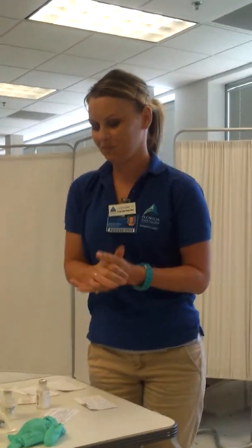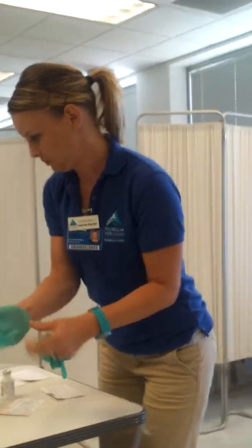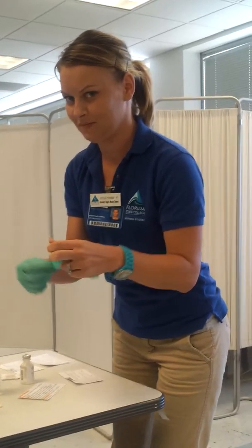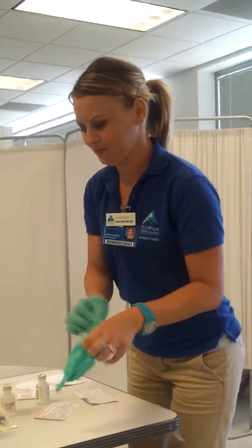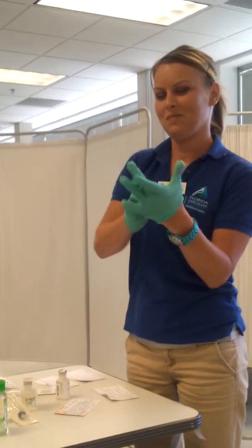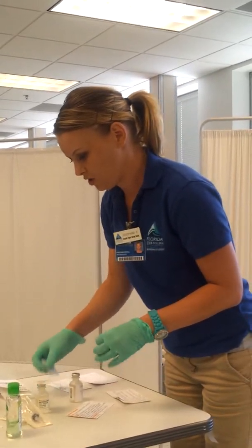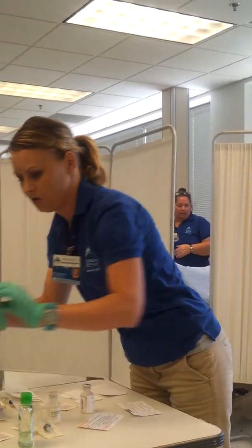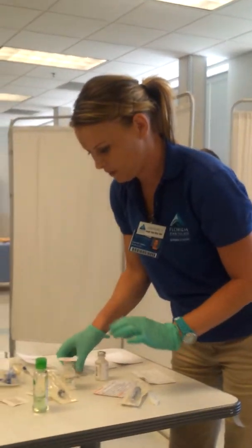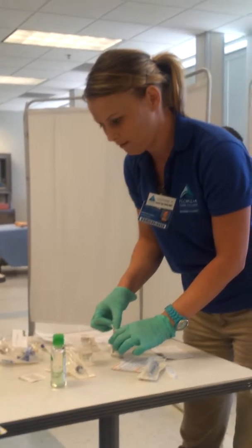So I'm going to do my hand hygiene and I'm going to put on my gloves. I'm going to get my syringe and my needle here, and I'm going to clean the top of my bottle of vancomycin, which I already figured I'd draw up half a milliliter.